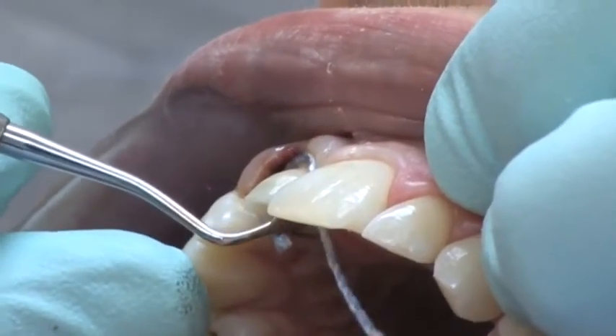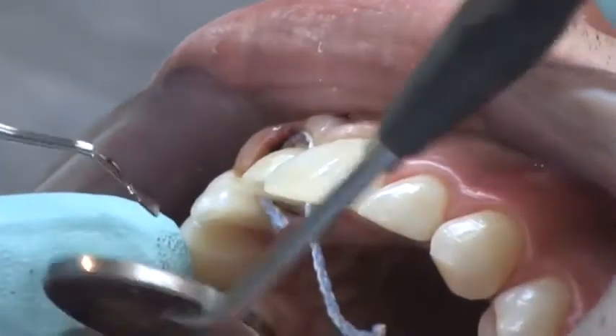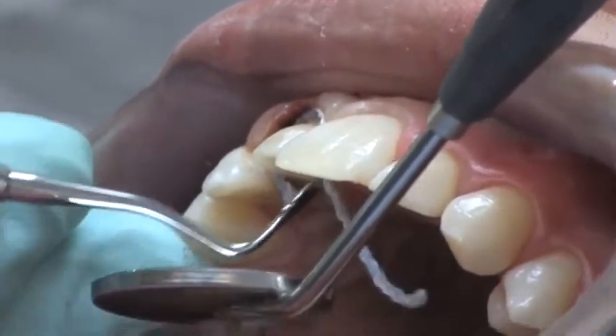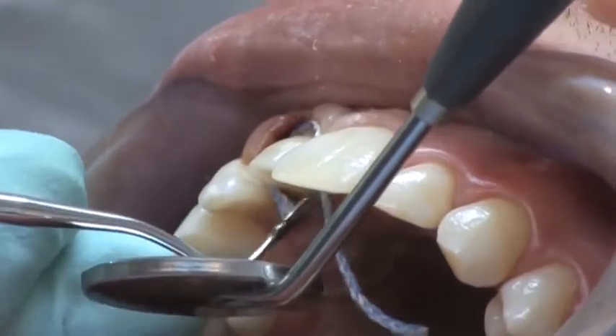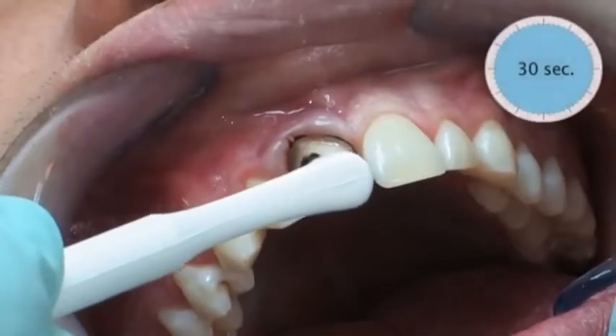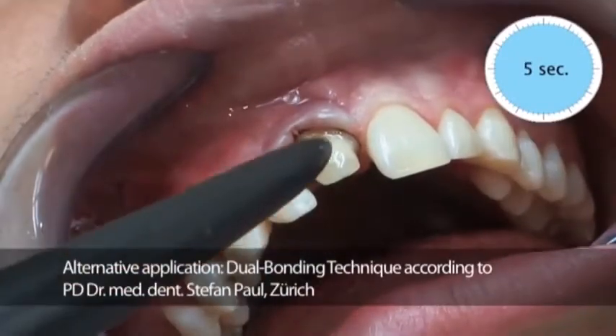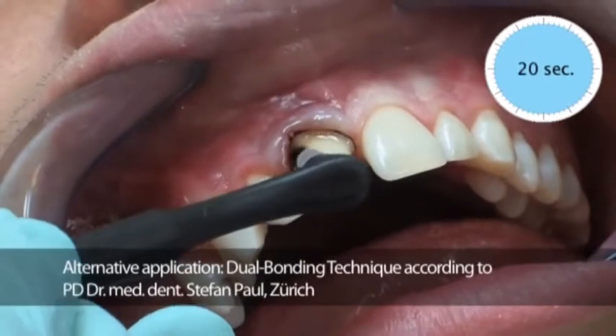Atraumatic compression of the gingival tissue is performed before the final impression is taken using a suitable retraction cord such as Compracord, with a stable structure and a high absorption capacity. Application of a multi-component bonding system such as ART bond before the final impression seals the dentin tubuli and increases the retention of the restoration.